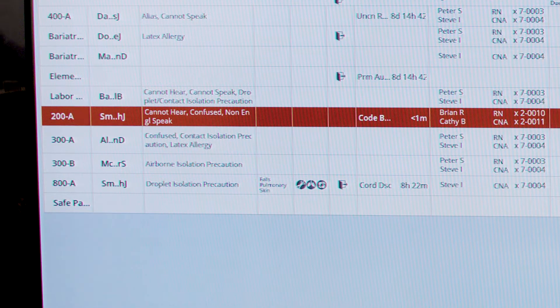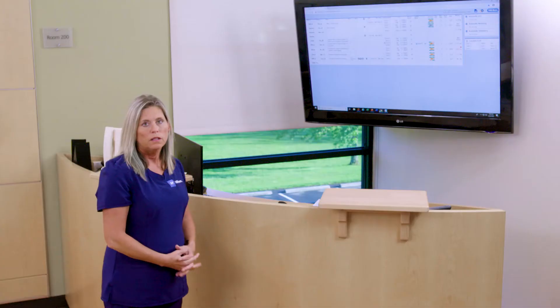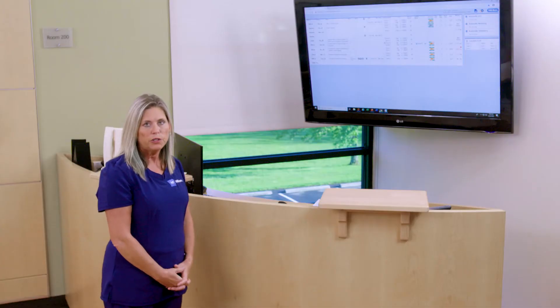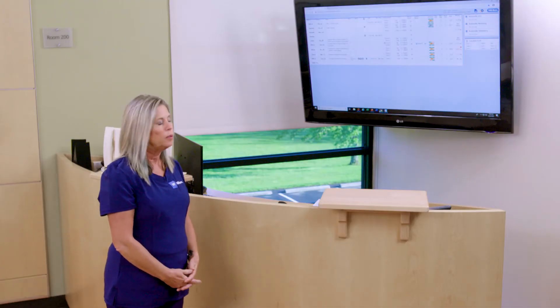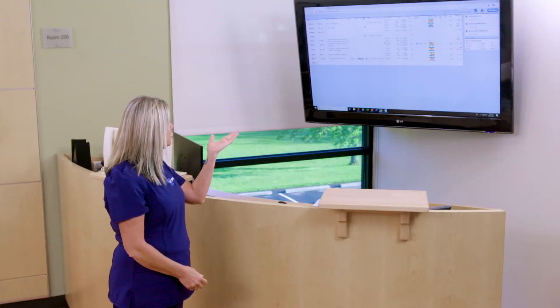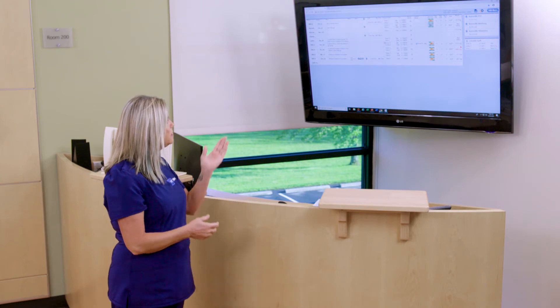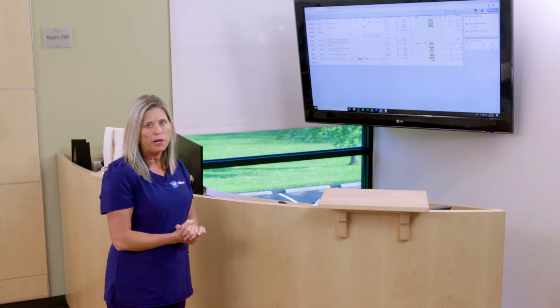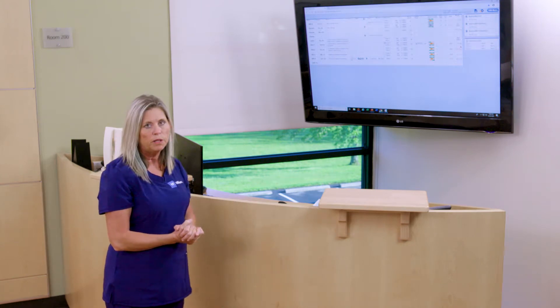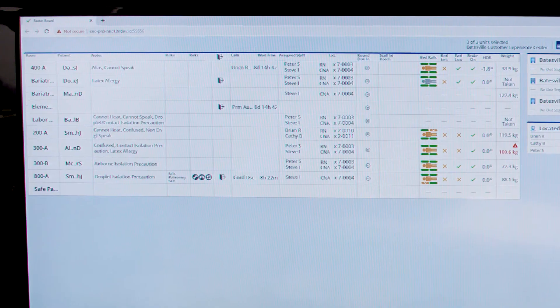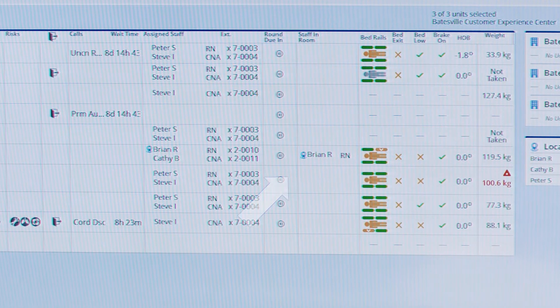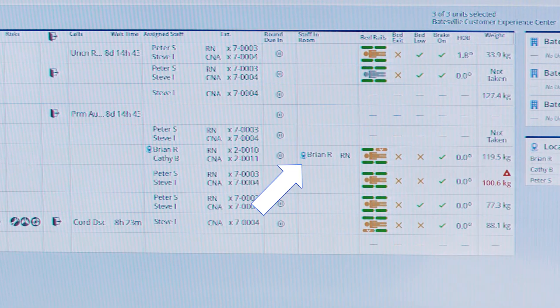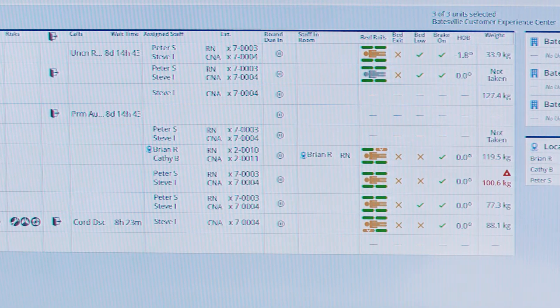If staff is utilizing the staff locating platform, on the status board we can see staff located in the room as well as the title of that staff member. Here you can see we have Brian RN located in room 200.